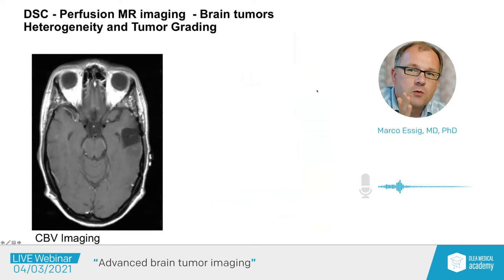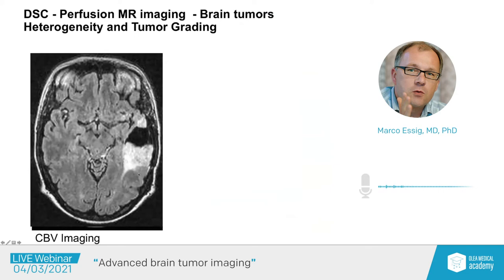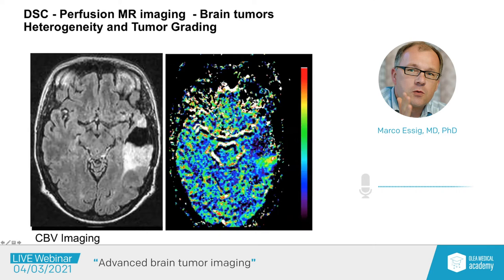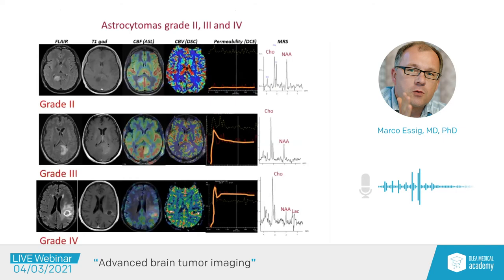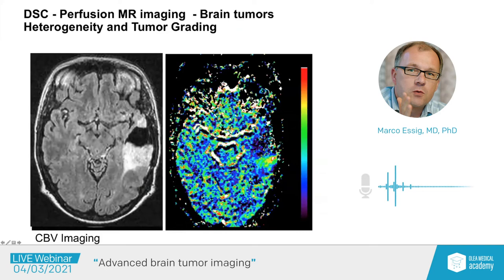In another patient who had previous surgery for a low-grade tumor, there is recurrence at the borders of the resection cavity — a very homogeneous tumor. We want to know: is this still low-grade or high-grade? Because those patients are managed differently. Adding perfusion reveals an area of high blood volume and blood flow representing a high tumor grade. This patient was diagnosed with a high-grade tumor and received completely different treatment than if it had been low-grade.